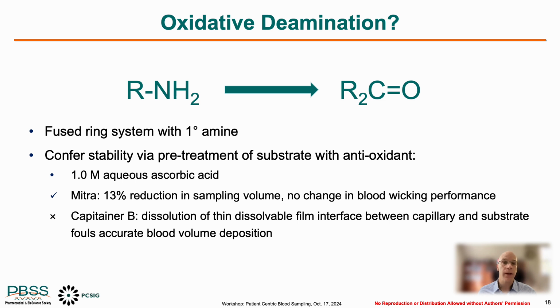I'll also make note that at the time that these experiments were being conducted, we did not attempt to pretreat the Capitainer due to concerns regarding potential dissolution of that thin dissolvable film, which would therefore foul the device performance. But my understanding from recent discussions with Capitainer is that they will pretreat the cellulose discs prior to device assembly.